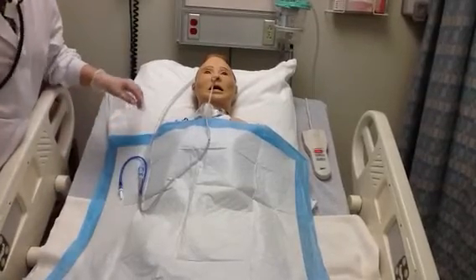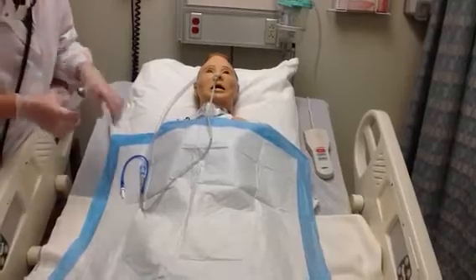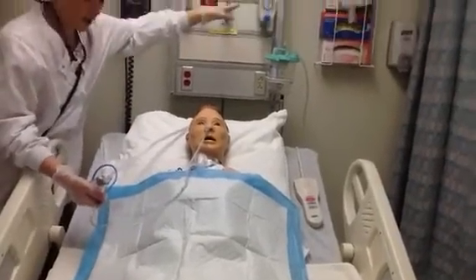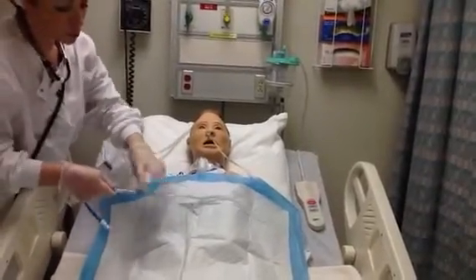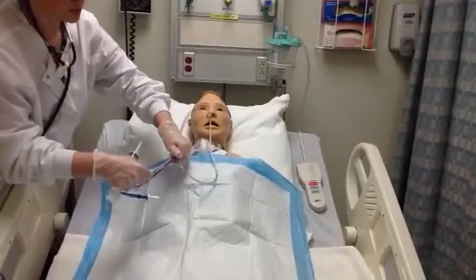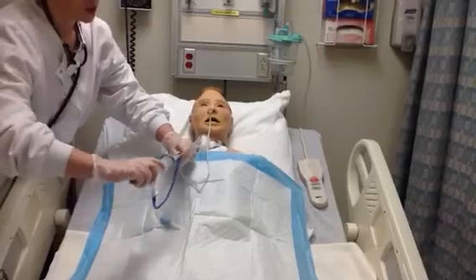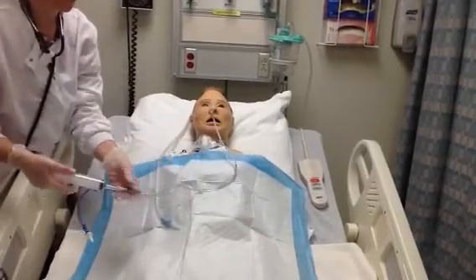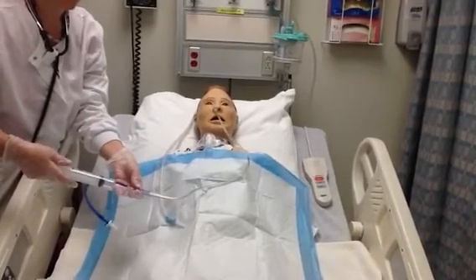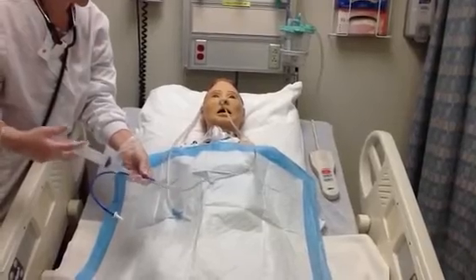Next, I want to assess for the position inside the stomach. So at this point, I want to shut my suction off, and I want to check for gastric secretions. So I'm going to close my NG tube so that nothing comes out at me. Insert my syringe, and I'm going to pull back, and I'm looking for an aspirate or the gastric secretions. And that way I know that I am in place, my NG is in my stomach.